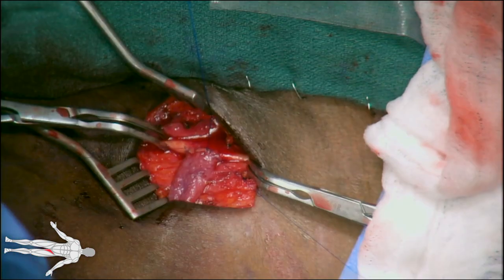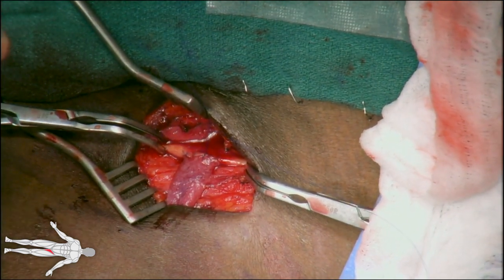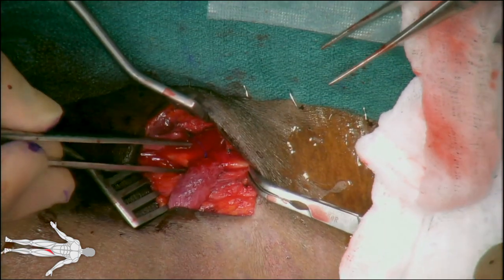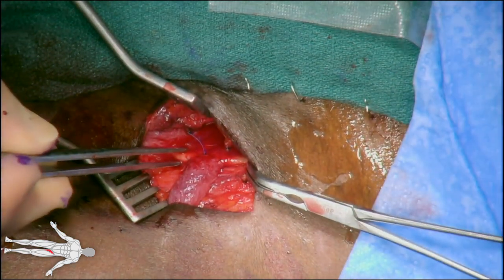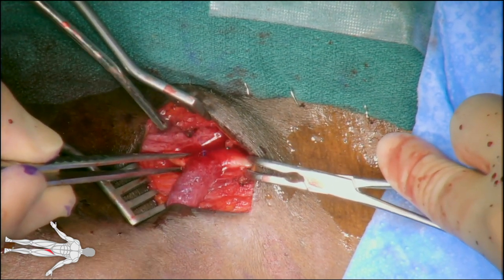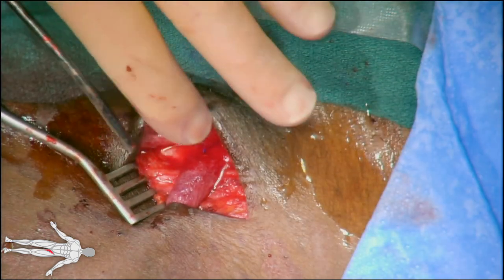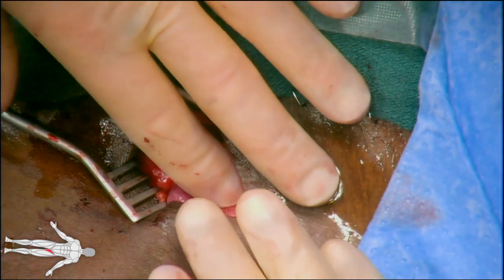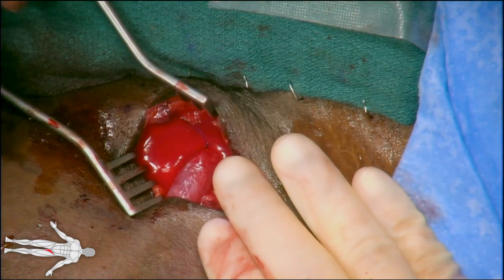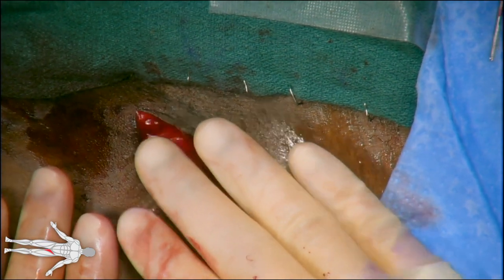Once the graft is created, we proceed with removing the clamps — first removing the venous outflow clamp, followed by the distal arterial clamp. The distal artery is then temporarily occluded and the proximal clamp is removed. This is done to prevent any embolization downstream to the leg. A thrill is then felt over the left leg AV graft. This concludes our video for creation of a left lower extremity arteriovenous graft.